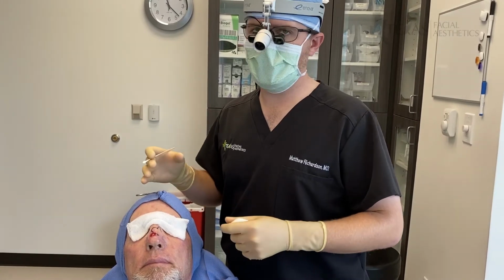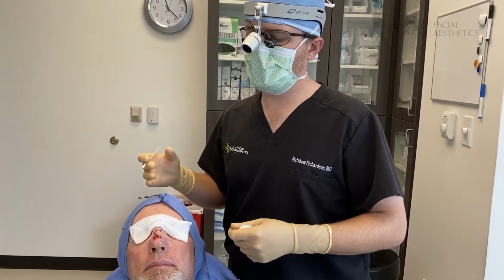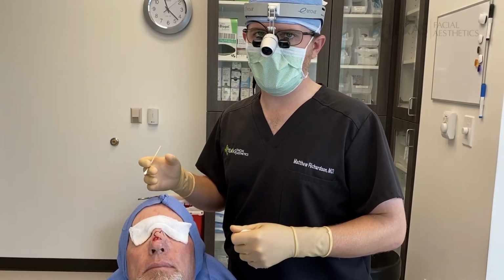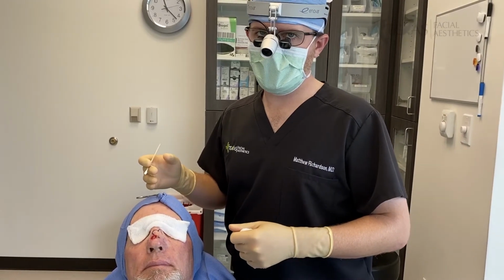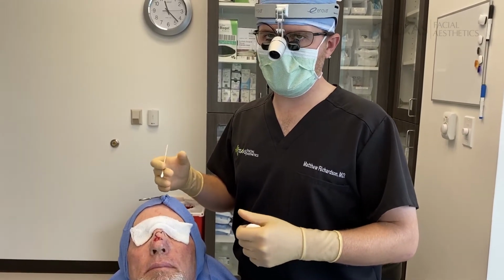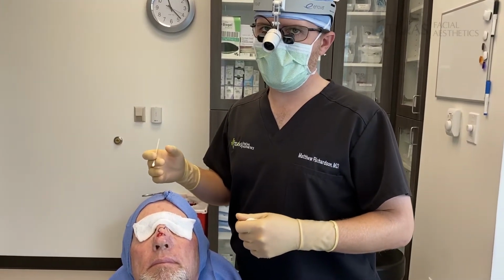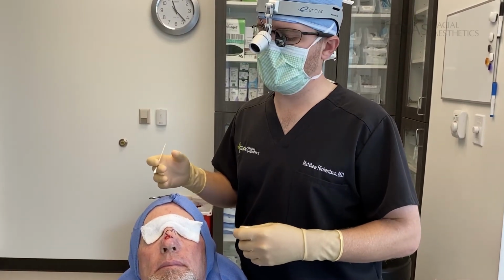So I just want to show you how we do this. There's a lot of different options for wound reconstruction. Of course, we could leave it open and let it heal, but that would take several months and cosmetically would not look good. We could also put a skin graft on here, but again, the cosmetic result would not be very good because the skin would not match. So in this case, and in most cases, we use a local tissue flap or an adjacent tissue transfer to reconstruct a defect like this.